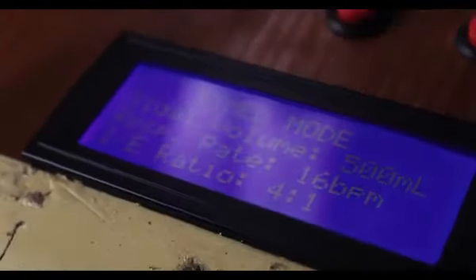There's a feature we also want to include in the app, which will include the history and the log of every action that is taken in the app. So everything that happens to the ventilator, you can go back to the history and view the patient's activity through this app.